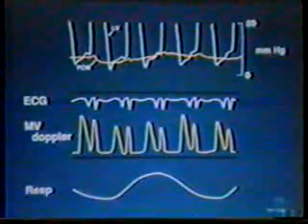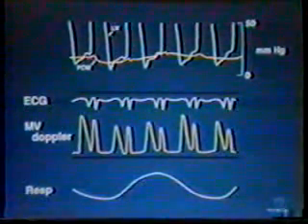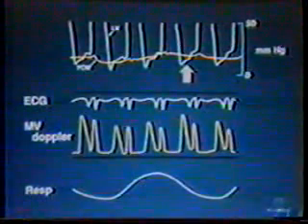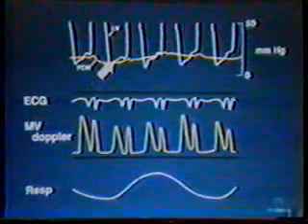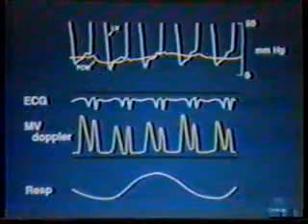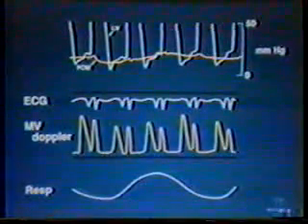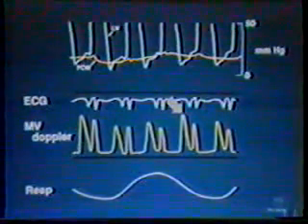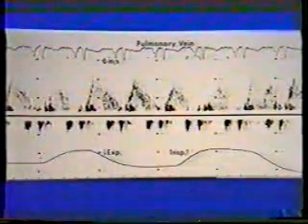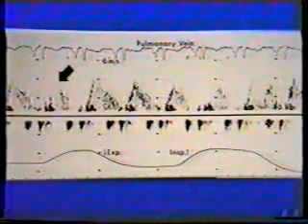This patient underwent left and right heart catheterization. We are focusing on the diastolic pressure curves, pulmonary wedge pressure, and left ventricular pressure. With inspiration, there is a marked decrease in the gradient between the wedge pressure and LV diastolic pressure compared to expiration. As we have already seen, this results in a significant decrease in the mitral E velocity with the first beat of inspiration compared to expiration. As expected, the pulmonary venous profile from this same patient with constriction shows a decrease in inspiration compared to expiration.